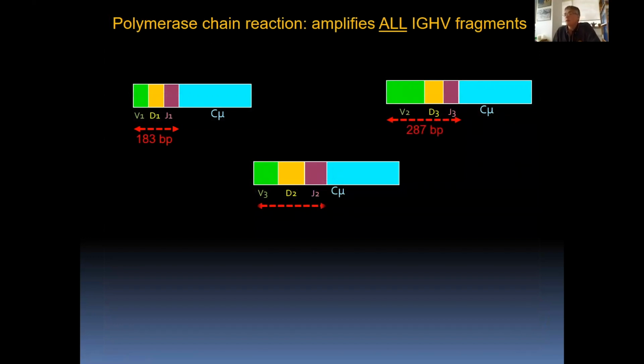We use the polymerase chain reaction in order to amplify and then study all the various VDJ recombinations present in a sample. For CLL, it is a blood sample that's usually taken, and the first step is to extract DNA and then amplify using common primers. We amplify all of the VDJ recombinations in that specimen. So you can imagine that if you have 1 million B lymphocytes, you will have practically 1 million different sequences that you all amplify.